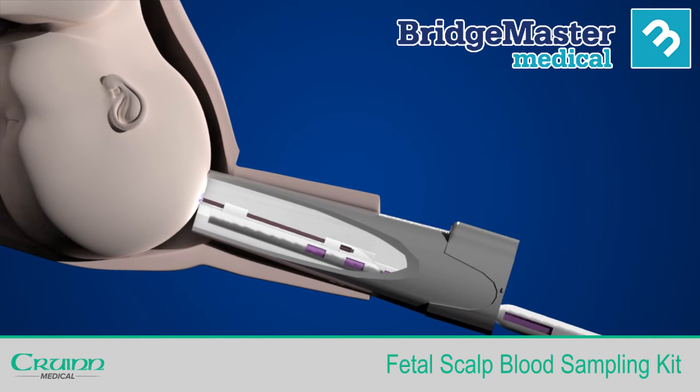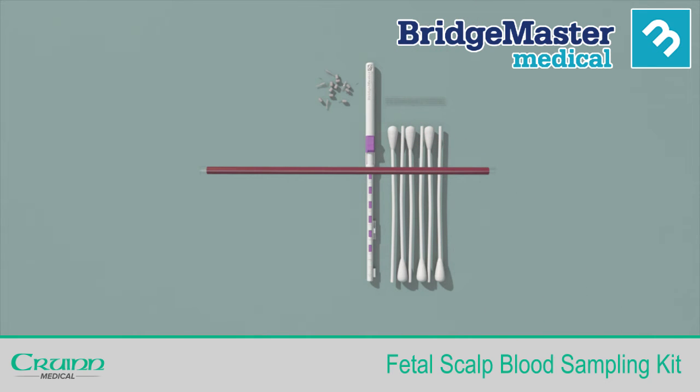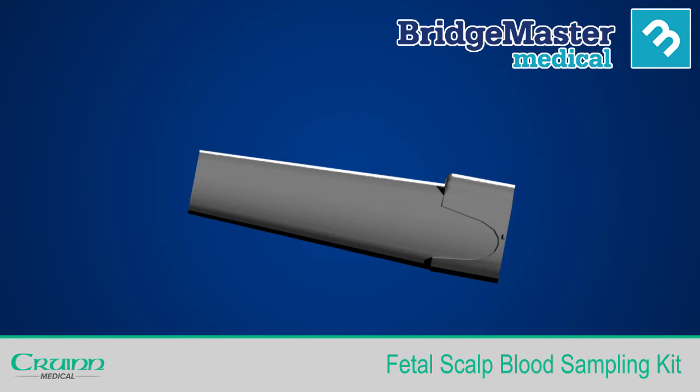Once you are satisfied you have an adequate sample, remove the blood sampler from the amnioscope. Now remove the capillary tube from the pre-mounted position and place the wand with the rest of the pack. Place end caps on each end of the capillary tube. Remove the amnioscope from the vagina and insert the obturator, switching off the light.